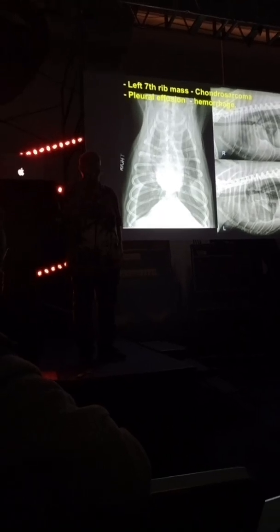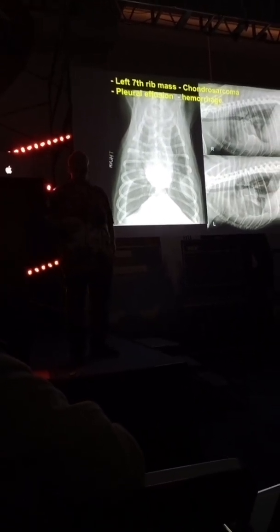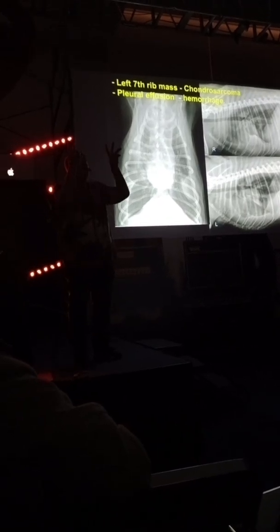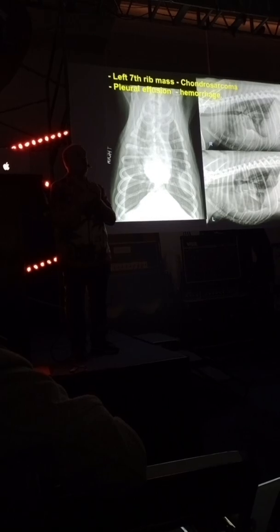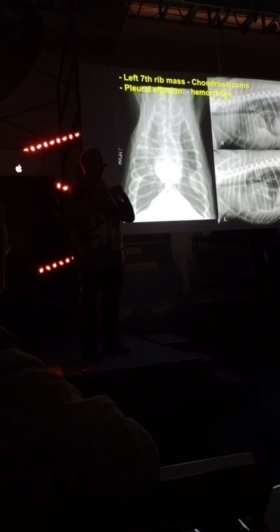A lot of times, if I see a nodule, a little wart, I'll put barium on the skin and re-radiograph the patient to see if that nodule that I see superimposed over the lungs is a skin nodule or a true pulmonary nodule. That way I can see the difference.